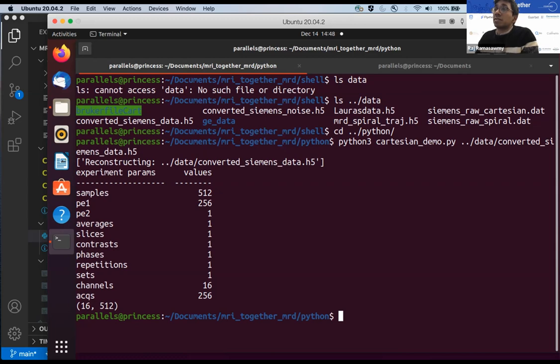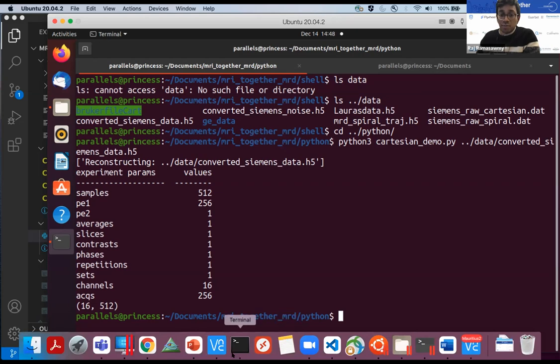And from which version? That's a great question. So yes, you're quite right. The Bruker development is a little stale. It was pushed at the time when we released the MRD format. And so the current ParaVision may not be connected to this. So for later on in this demonstration, I'm just going to show you, because I think we're probably going to run out of time here.